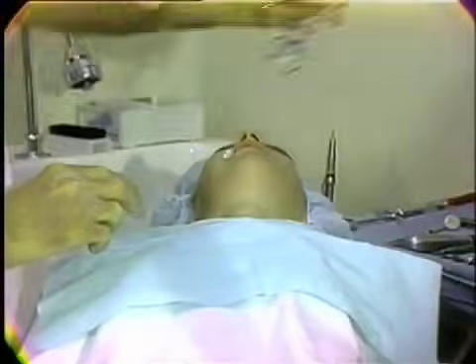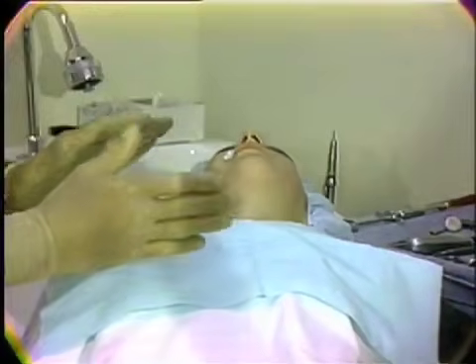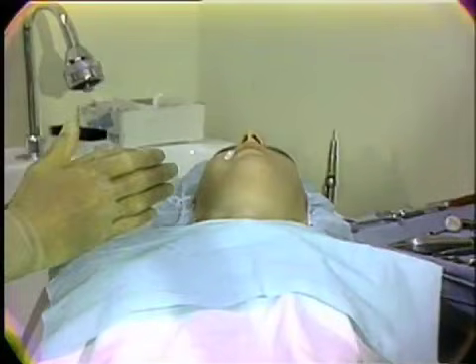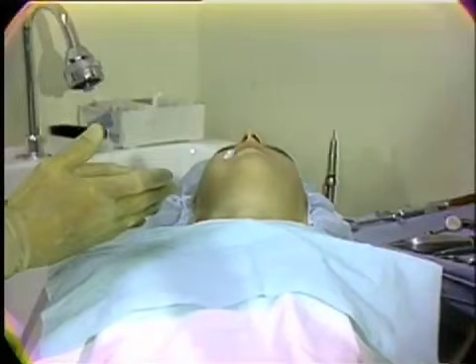When the final sutures have been placed, and incidentally, before you close, before you insert any sutures, an instructor's check is required. This is necessary to make sure that the contouring of the ridge is satisfactory. So when that has been attained, you'll proceed with the closure and the insertion of the last sutures.